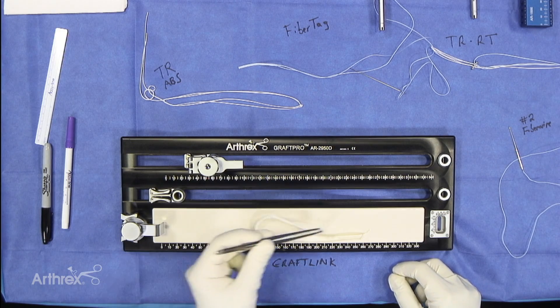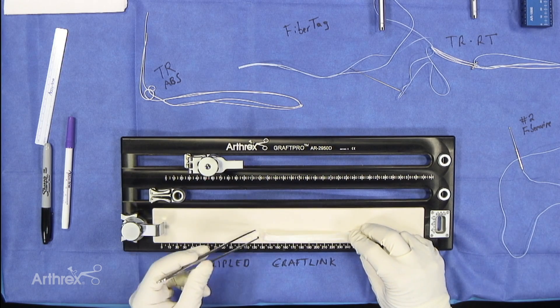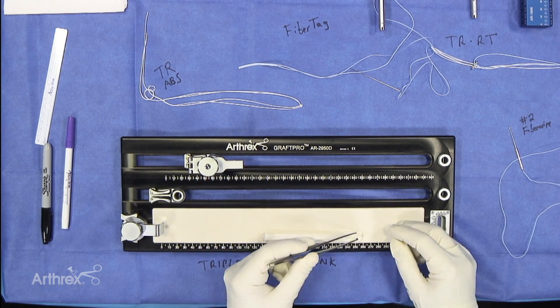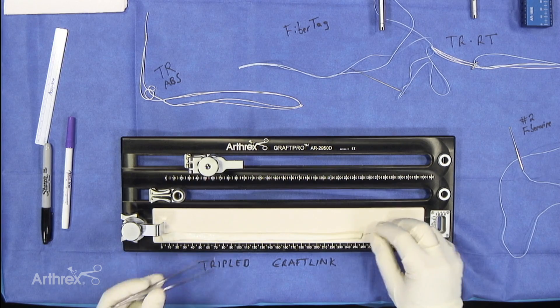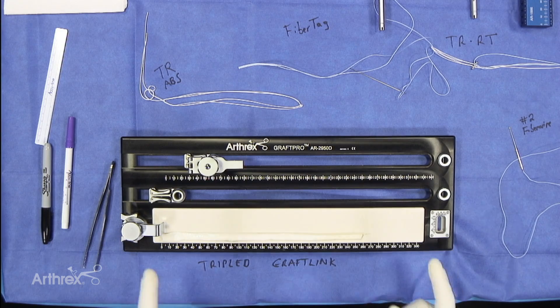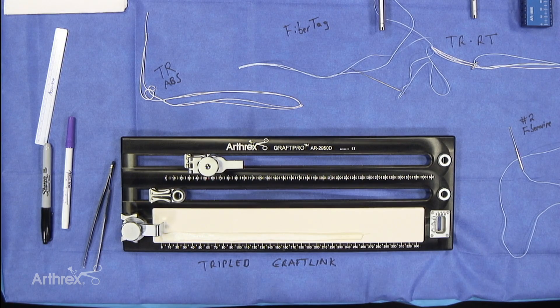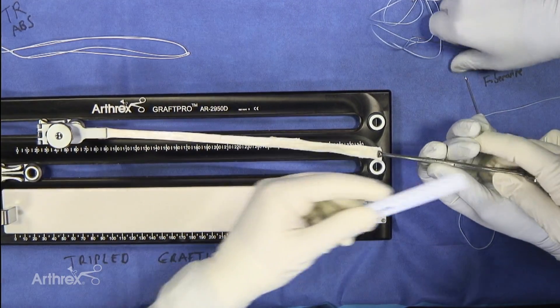And folded, when we test this, it's about nine, nine and a half. You'll see once we have it tripled, that it's going to end up hopefully being around 11 or 12 millimeters in thickness, with a total length of about 90 millimeters. Now we're going to prepare the graft with the fiber tag.